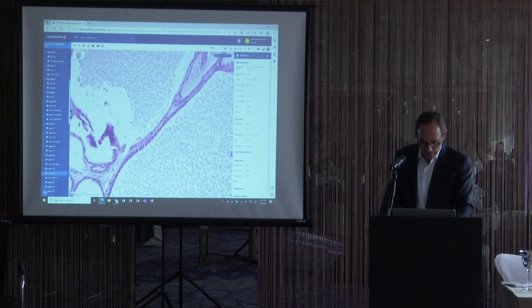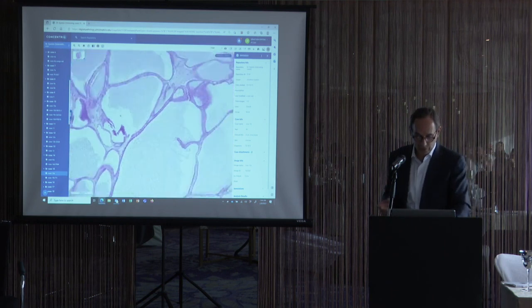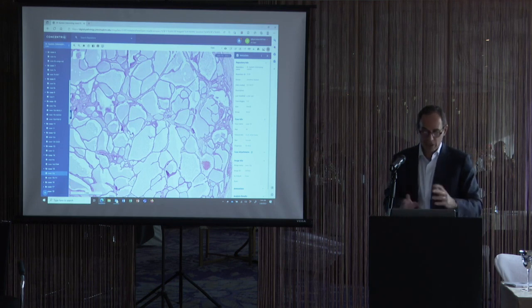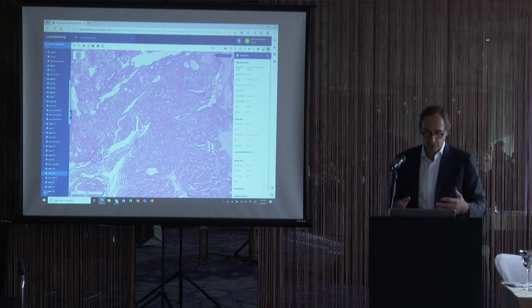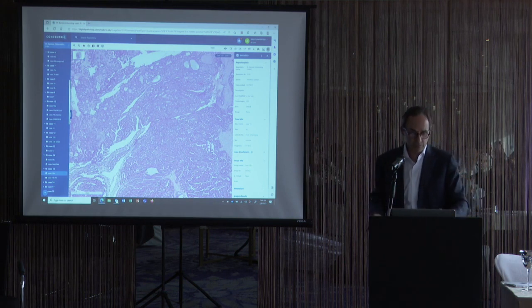And if we would go down and look at them, just like the case I showed you, they're not normal. They have prominent nucleoli, they're irregular. So this area of the tumor is tubulocystic carcinoma. Again, think of tubules that are cystic, just the name. But tubulocystic carcinoma by itself should look just like this. Shouldn't have solid areas, shouldn't have more complex areas. Then we come to this area. This is too complex for tubulocystic. So this is tubulocystic carcinoma with poorly differentiated foci, what I talked about earlier.